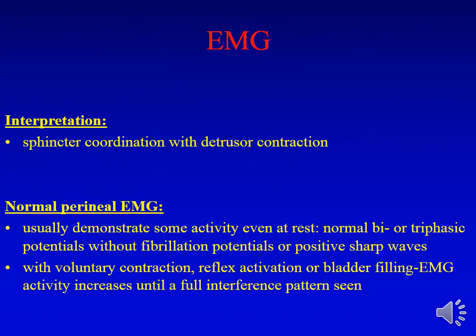Now it's very important that one knows how to interpret the EMG. Strictly speaking, in interpretation, normal sphincter coordination with detrusor contraction is what we see normally.